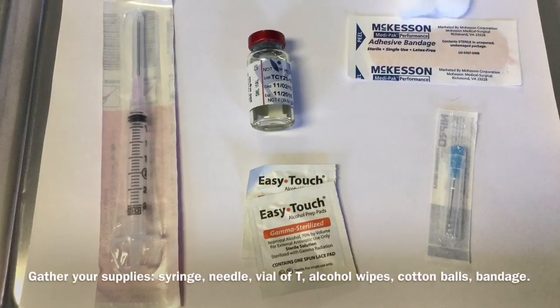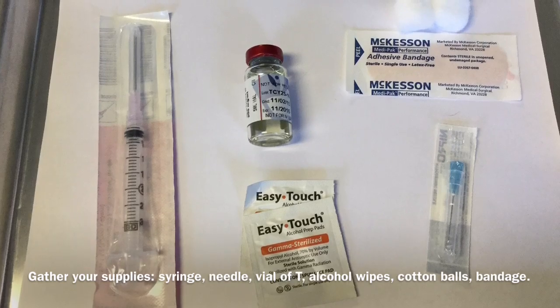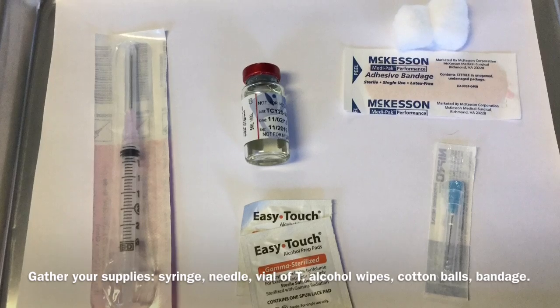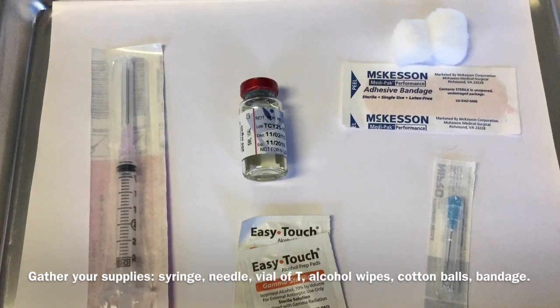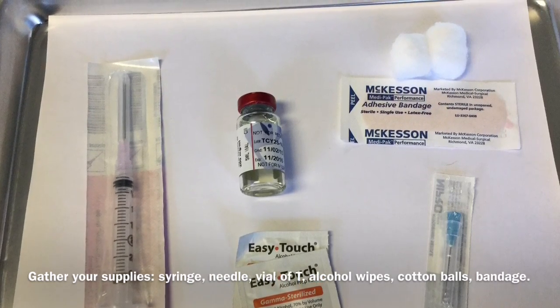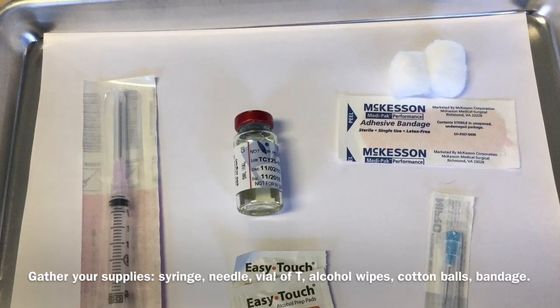First things first, lay out all of your supplies that you'll need for the testosterone injection. That includes the 3ml syringe with attached 18-gauge or similar needle, a 25-gauge needle for the injection, a 5ml vial of testosterone, an adhesive bandage, two cotton balls, and two alcohol wipes.